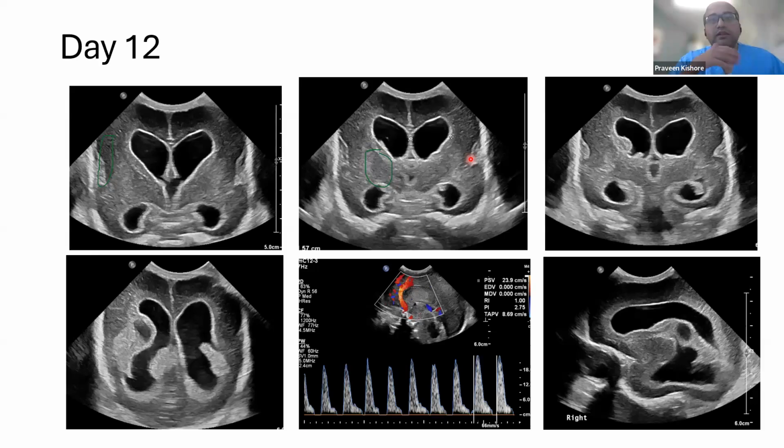That said, in our machine there are 3 probes that we use, and with the settings that have been used on this probe, you can see even the rest of the images are quite bright. That's why, if we go back to the physics and how to optimize your cranial ultrasound imaging, it's quite important to make sure that the gain is optimized. These days we use a Philips machine and it has a button which says eye scan. If you press that, it will bring you automatically to the optimum setting for a cranial ultrasound, or for an echo, or for a vascular scan.